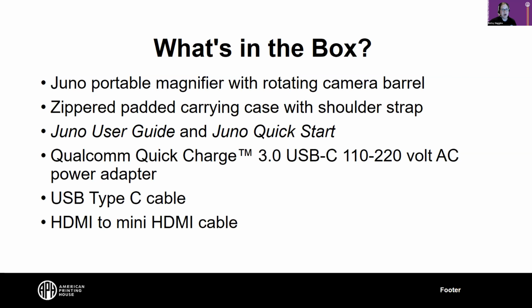Great. And are the user guide or the quick start guide also built into the Juno? Yes, so the user guide is built into the device, but it also comes with the physical booklet for the user guide and a quick start. And the quick start fits into the case. It'll fit in there with it. Oh, that's very convenient for carrying it around.